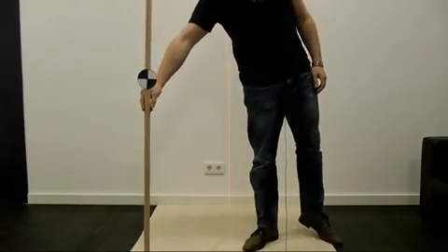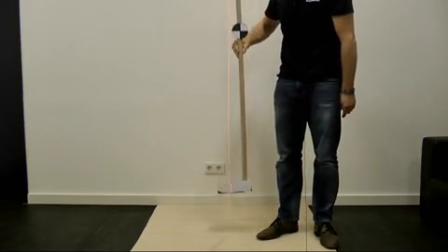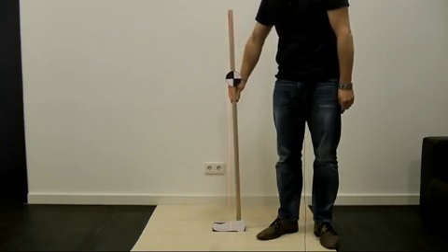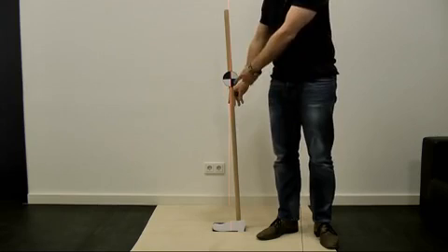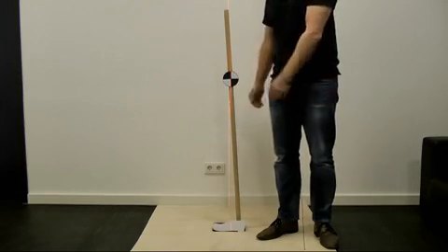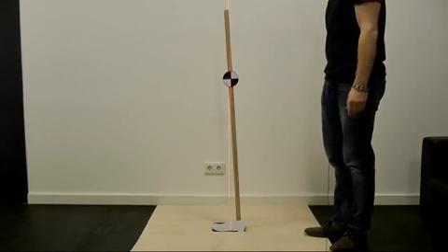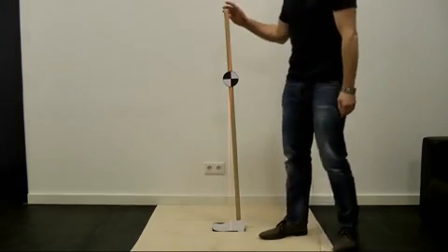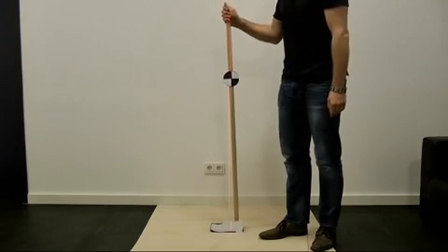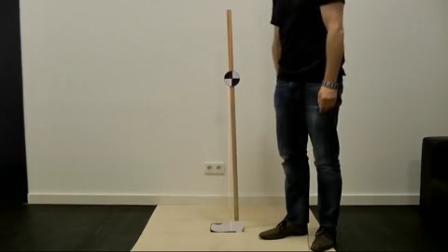We expect the plumb line to fall between the body's center of gravity and the available supporting area. And we see that we have achieved that, and it is stable. The broomstick can stand stable without my intervention because we have extended the area of support, and this will provide more stability.